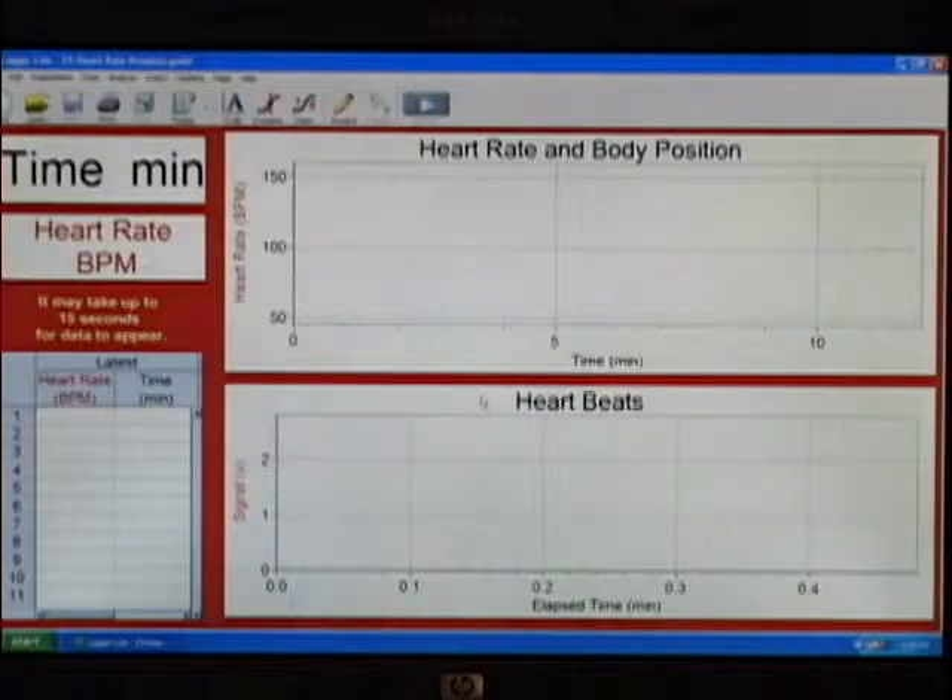As this opens, you'll see it changing a little bit. We have two graphs. The top one is going to be the heart rate that it calculates, and the bottom one is the raw signal of the actual beats.